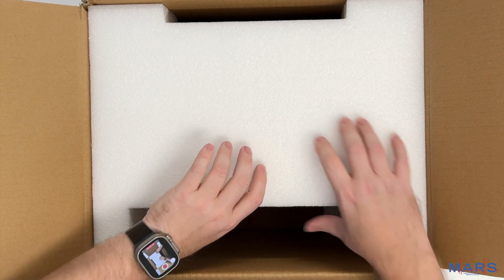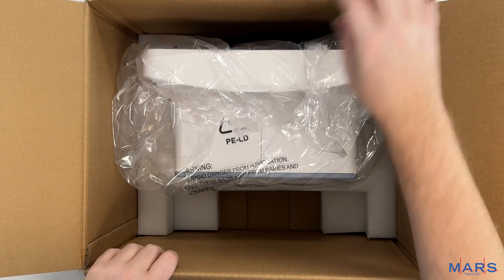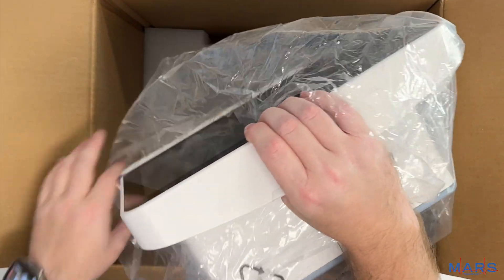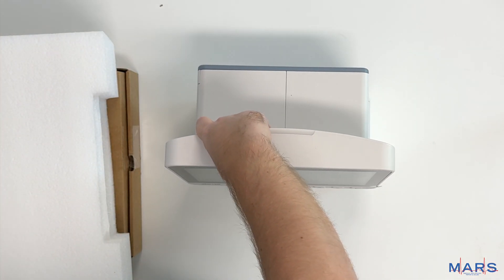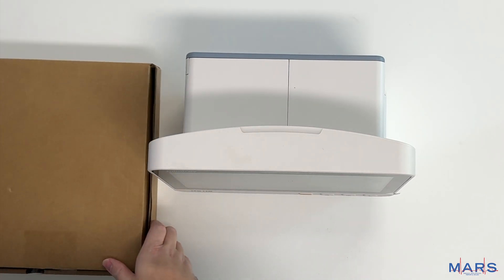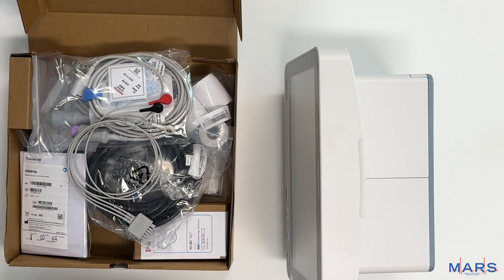If we look inside this box we will have up under the foam our patient monitor, and we can set the box aside. So what we are left with is our patient monitor as well as all of the accessories.